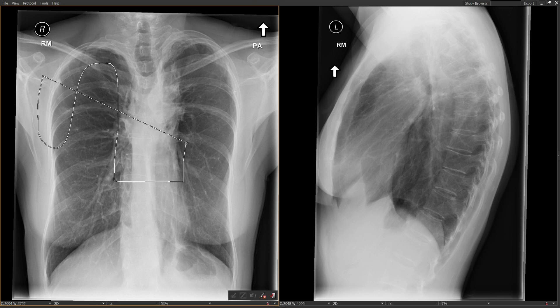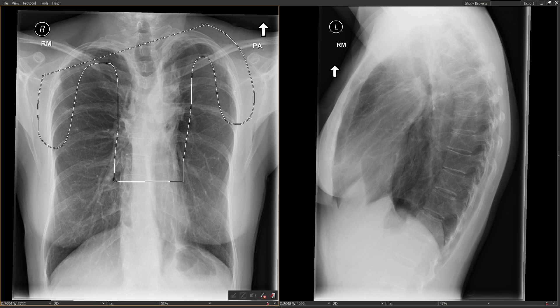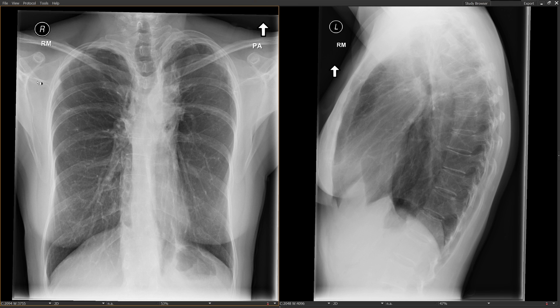The mantle field covered the axilla, the supraclavicular region, and the mediastinum — so this would be the approximate area that received radiation. Looking at this chest X-ray, the first finding is that the borders of the mediastinum are not as crisp and clean as we usually see in a normal patient, because the lung adjacent to the mediastinum has fibrosis in it.